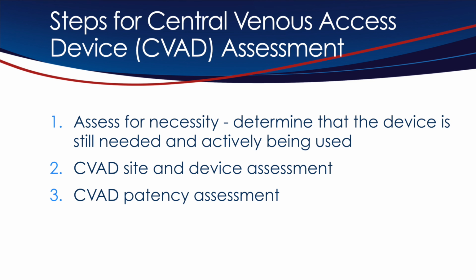The first is to assess if the device is necessary. Is it still needed and actively being used? The second step is to assess the site and the device. The third step is to assess for patency.